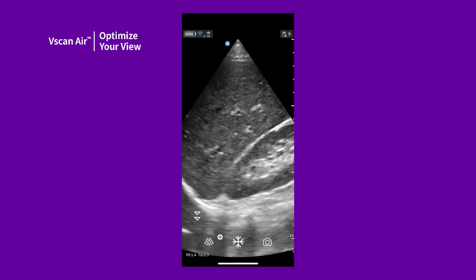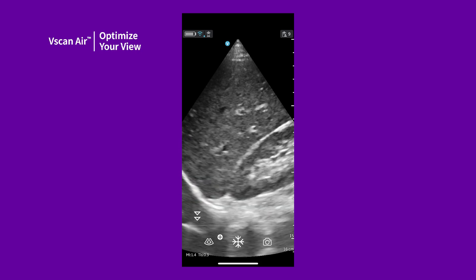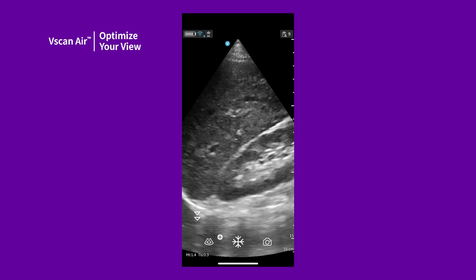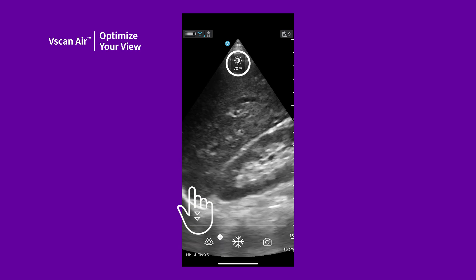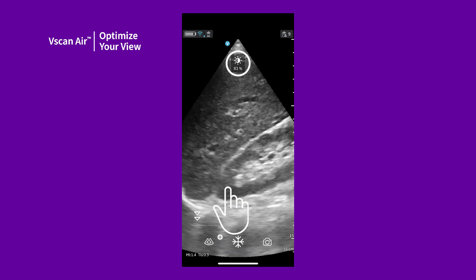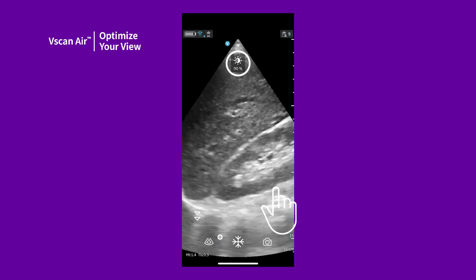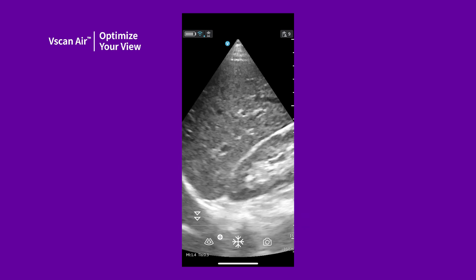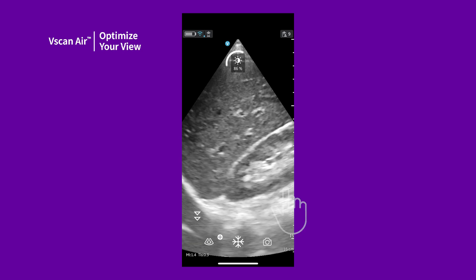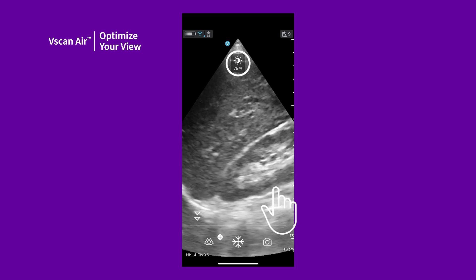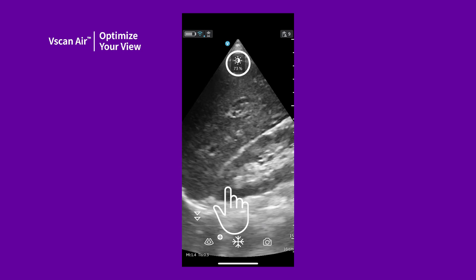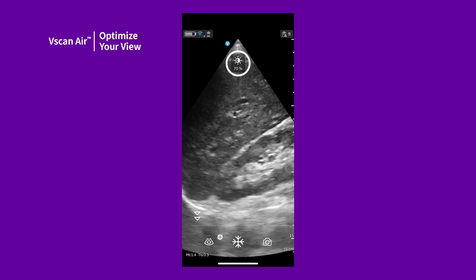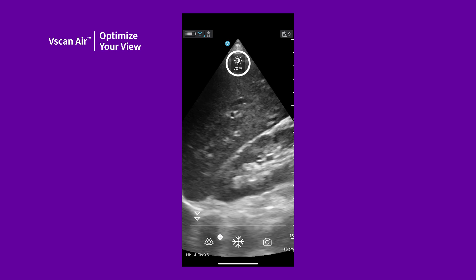Gain and depth gestures are available to adjust the image during live scanning. Swipe from left to right, dragging your finger across the image to increase overall gain, and left to decrease. The icon on the top indicates the change in gain value.